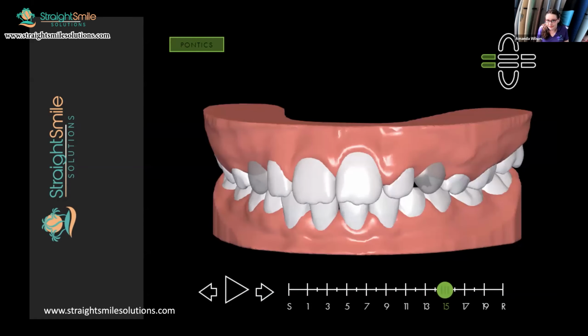Also, cool things to know: aligners can be done as phase one now. This was kind of novel when I first made this slide a couple of years ago, but it's definitely more accepted now. Obviously, Invisalign has their Invisalign First they came out with, as well as their MA, but ClearCorrect can do it too. They don't have a specific product, but you can just ask for it.